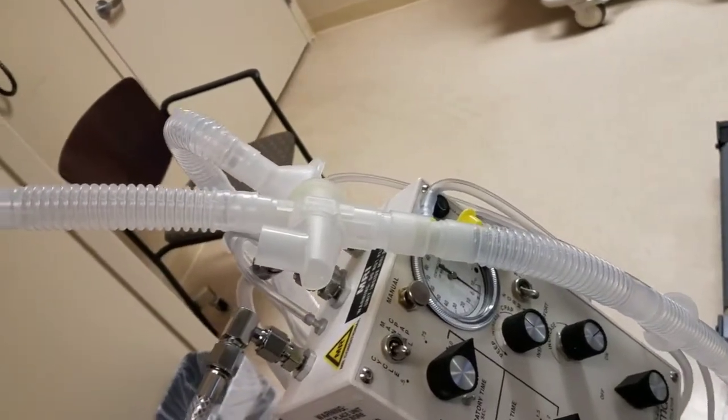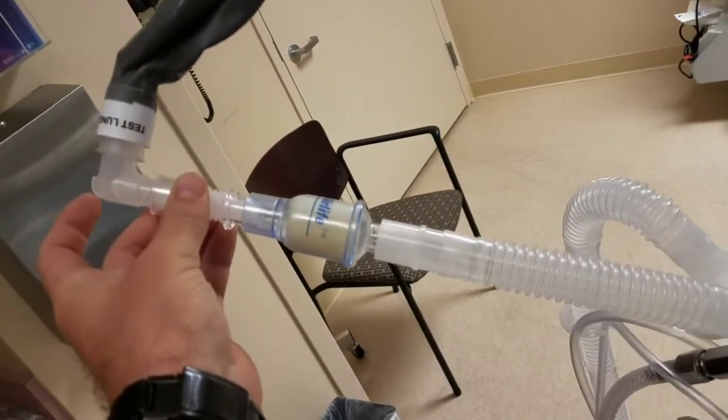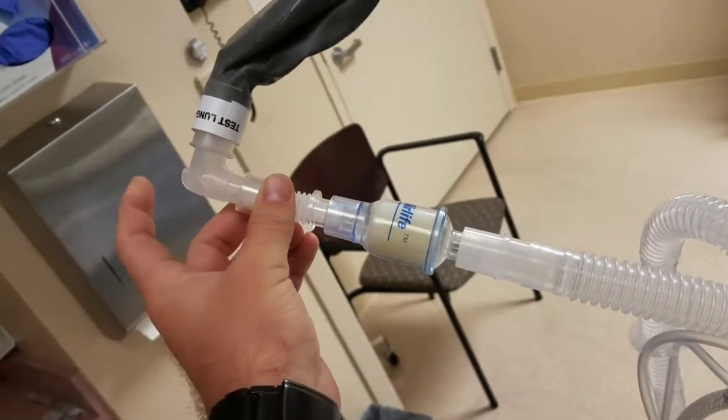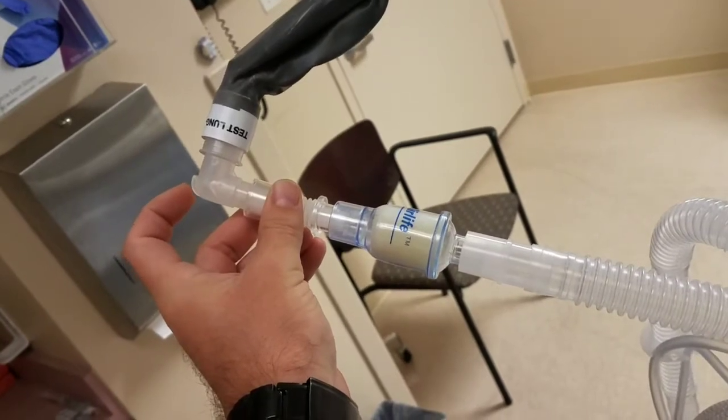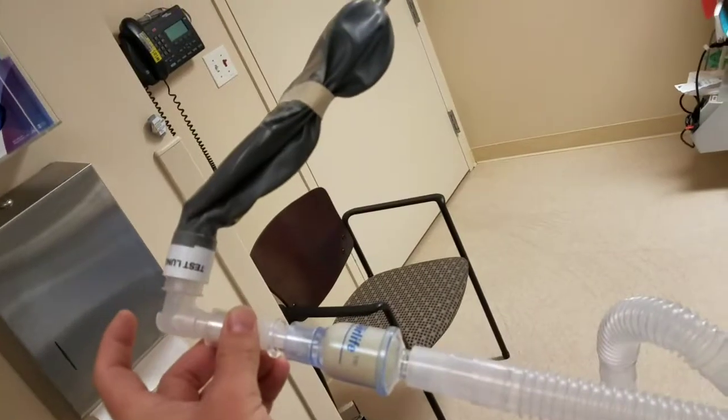Once again, circuit followed by corrugating tube, then adapter, HME, and your elbow, which gonna be with tidal CO2 line, and you connect that to the patient.